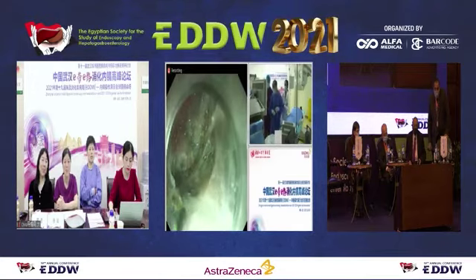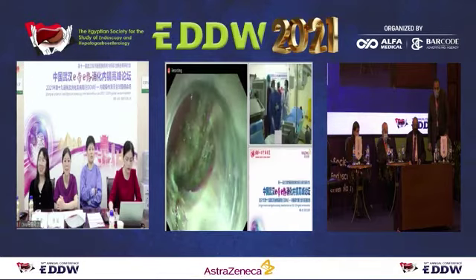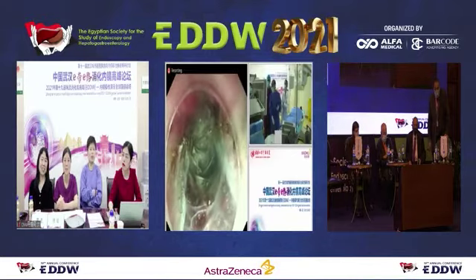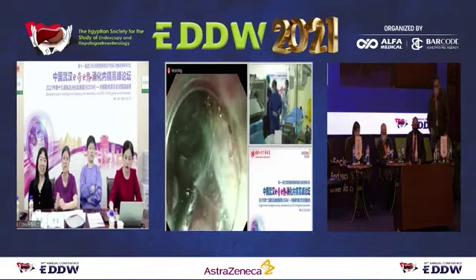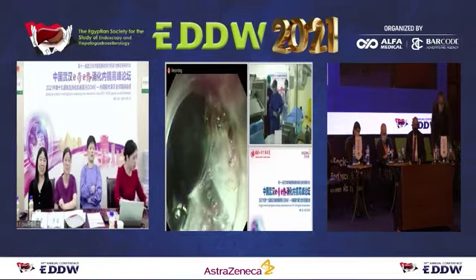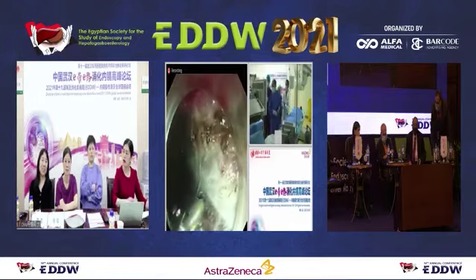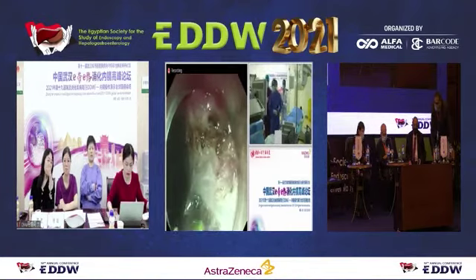I don't think there's any need to treat this further. So Professor Wang is the master of ESD. He just did this procedure in maybe 20 minutes.